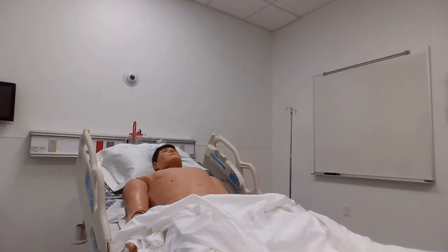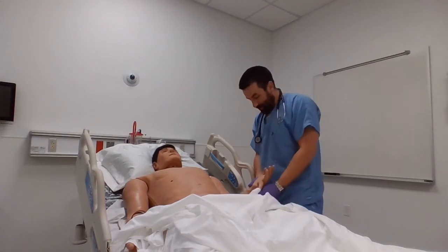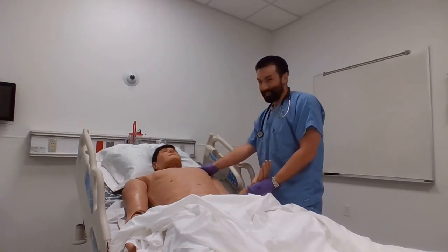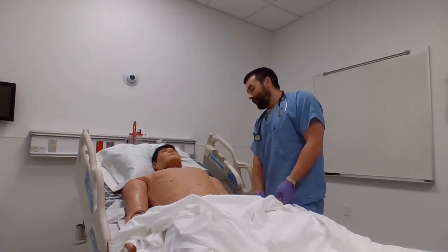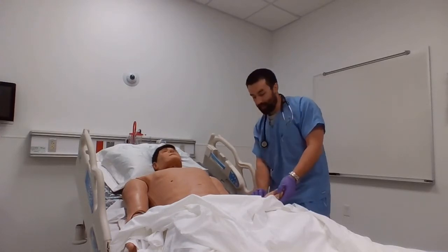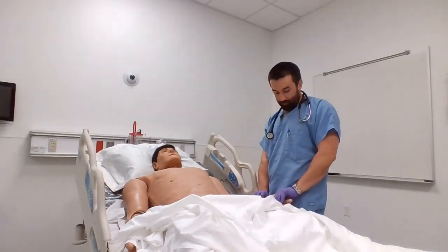Been having any trouble with your breathing? A little sleepy, huh? Okay, let me check your wristband here real quick. Alright, can you tell me your name and date of birth? No? A little sleepy — okay, that's all right. So I'm going to borrow your wrist here. I'm going to check your heart rate real quick, and then I'm going to check your blood pressure as well and check on your oxygen.